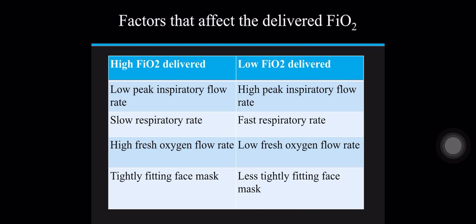Okay, let's discuss the factors that affect the delivery of FiO2. FiO2 delivery depends on peak inspiratory flow rate, respiratory rate, fresh oxygen flow rate, and how well the face mask fits. I will explain later the importance of peak inspiratory flow rate in delivering FiO2. It is inversely related: if there is a low peak inspiratory flow rate, high FiO2 can be delivered to the patient.